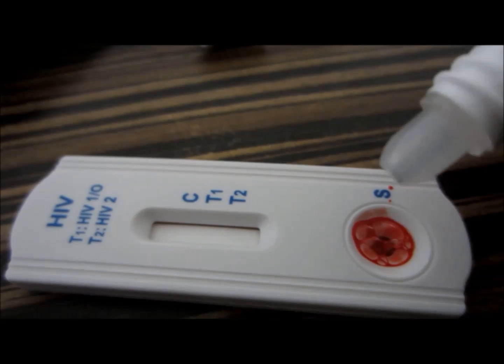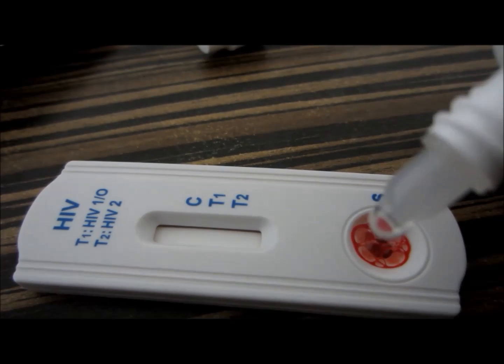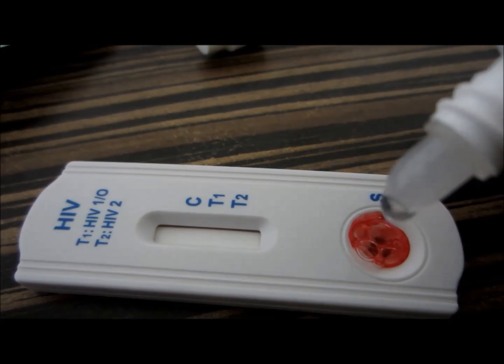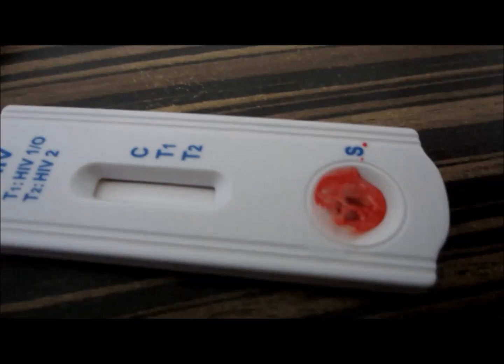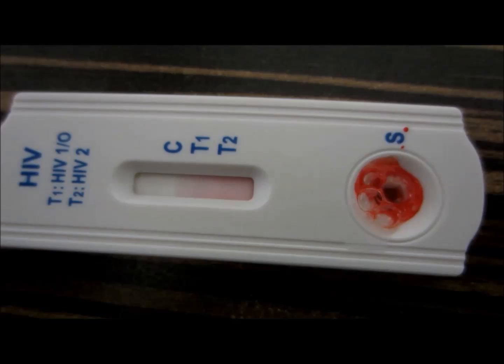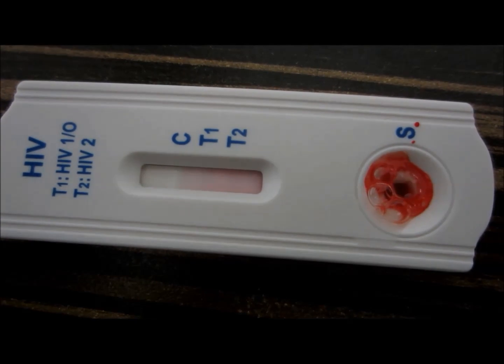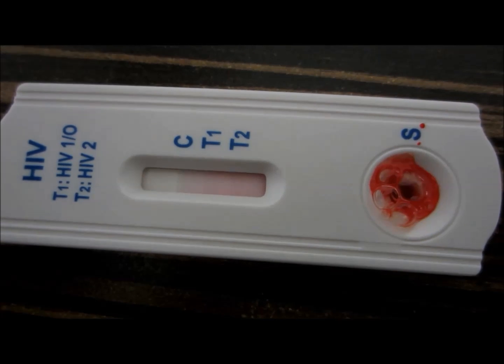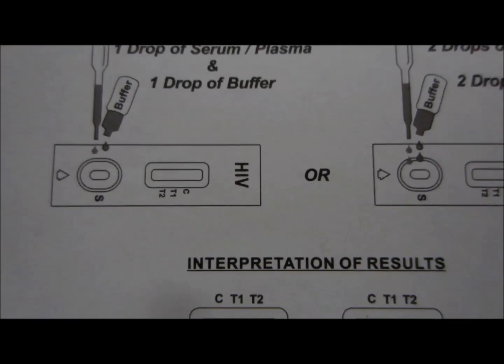and with two drops of blood you need to put two drops of buffer in the sample well, which is indicated by S. C indicates control, T1 and T2 are shown here — T1 is HIV-1 or group O, and T2 is HIV-2. Put two drops of the blood sample, then two drops of the buffer, and wait for 10 minutes.